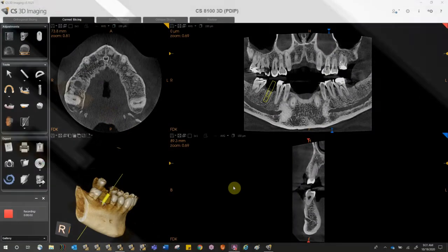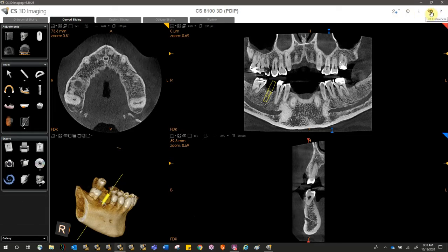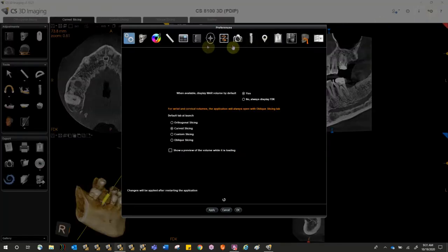So when using the review tab and the annotations bar, there's a couple of things I would maybe do first if you haven't already done them. I would go up into your preferences, so up in the top right-hand corner, fourth icon over, the little gear cogs. I would select that, and then I would go to your colors.